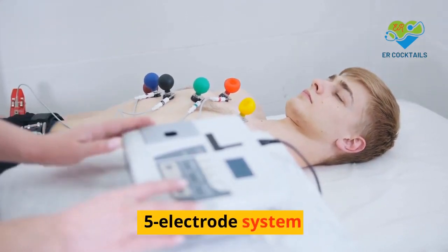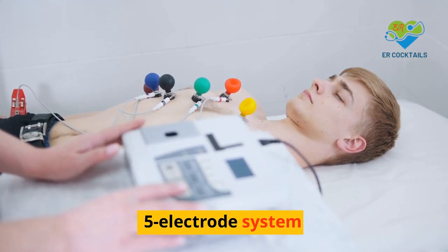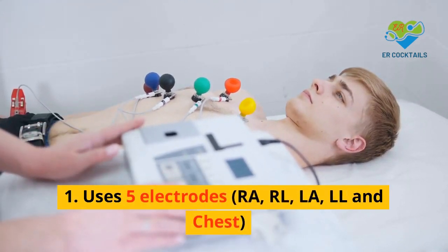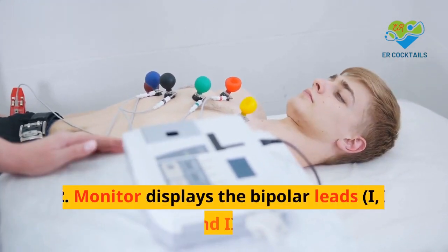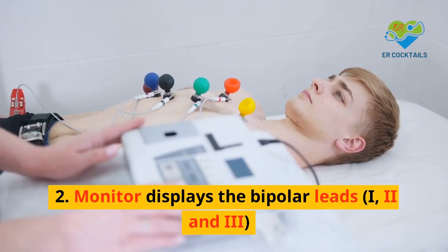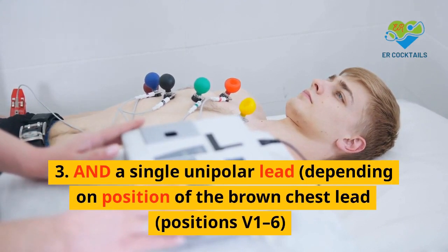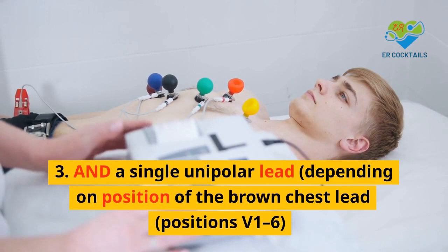5-electrode system. 1. Uses 5 electrodes: RA, RL, LA, LL and chest. 2. The monitor displays the bipolar leads I, II and III. 3. And a single unipolar lead, depending on the position of the brown chest lead, positions V1 to V6.